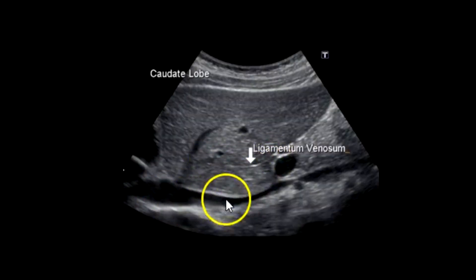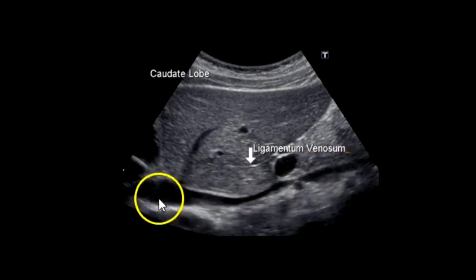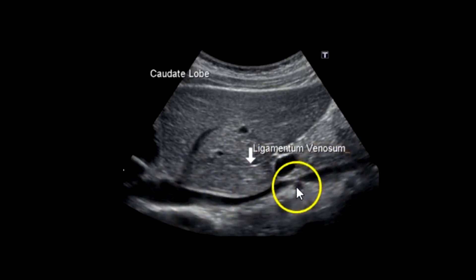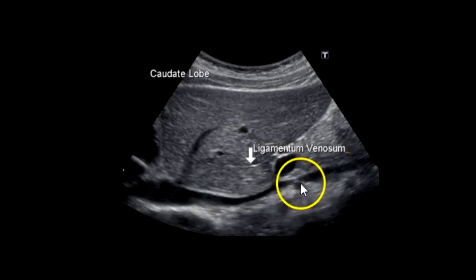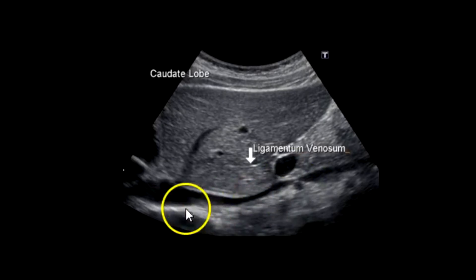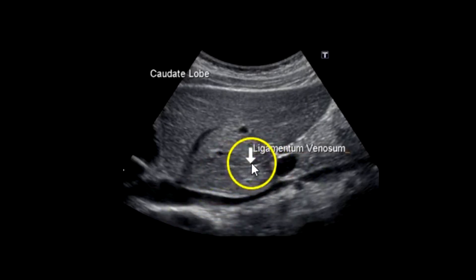In this image you can see the IVC is more collapsed than on the other patient. Here is your right renal artery, which is usually posterior to the IVC. And a nice view of the ligamentum venosum right here — this echogenic fissure.